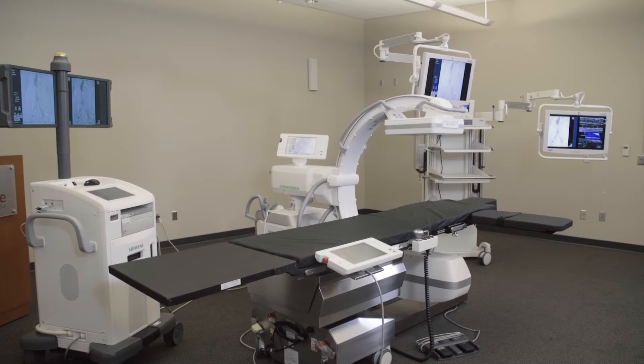What we're utilizing is a C-Arm, a table, and our mobile boom that will display ultrasound images as well as any other type of video source that you'd like to display during the procedure.